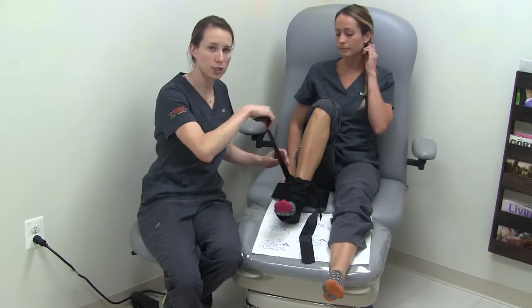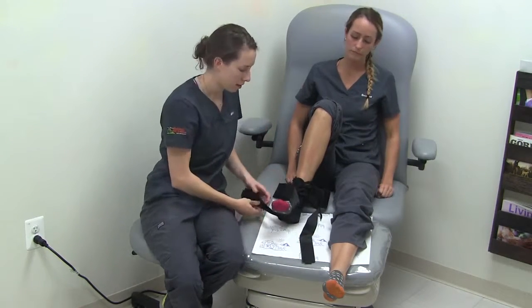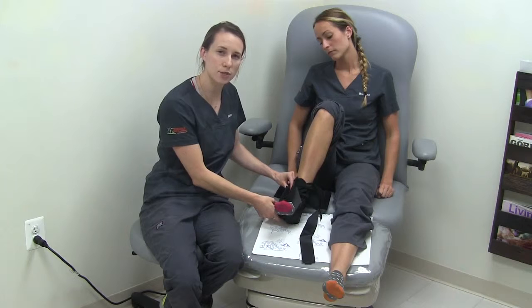Take the first strap, cross over and under your foot, back up to the same side, and attach with the Velcro.